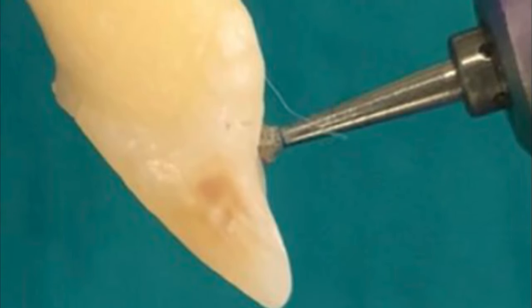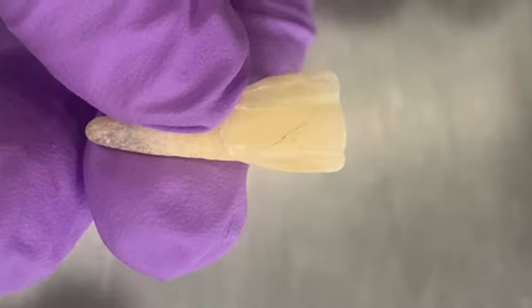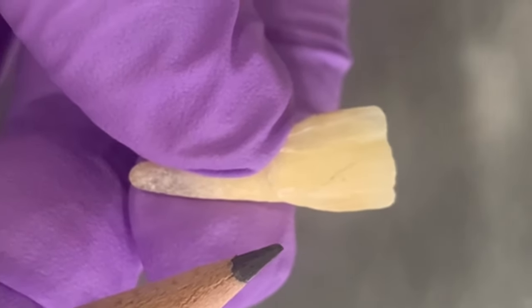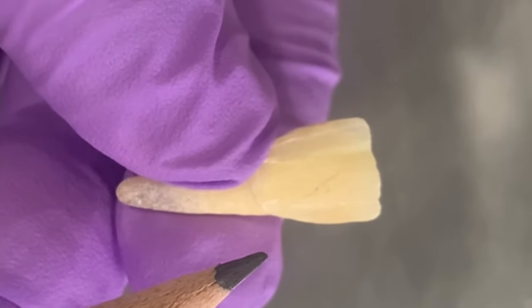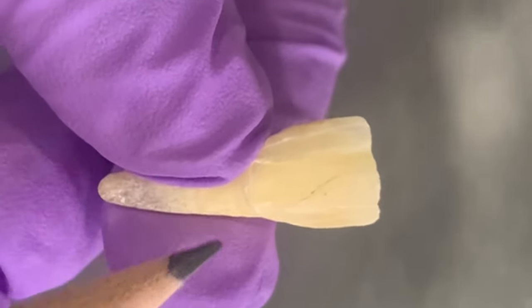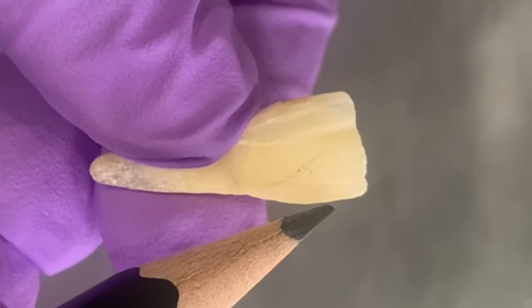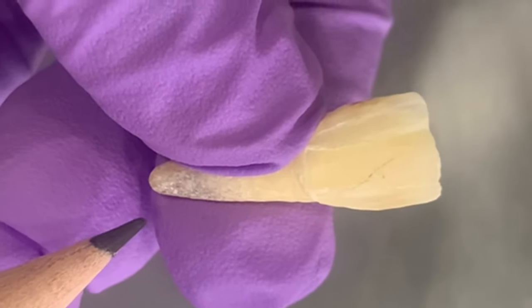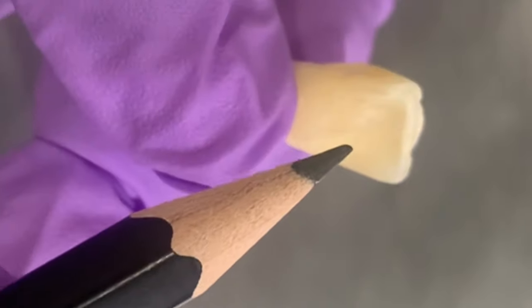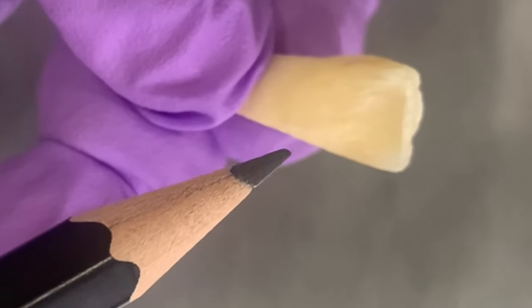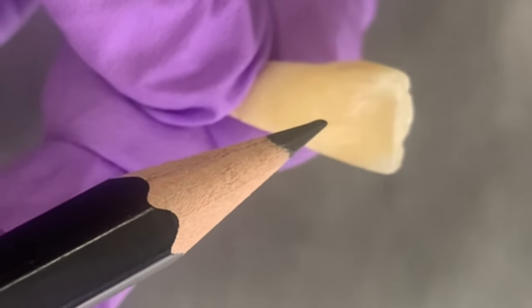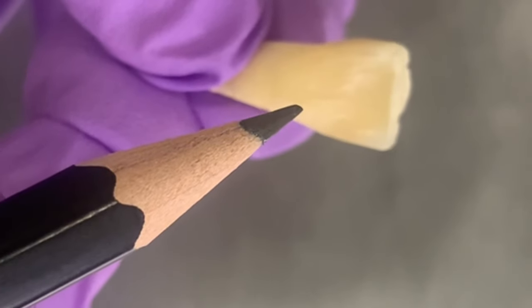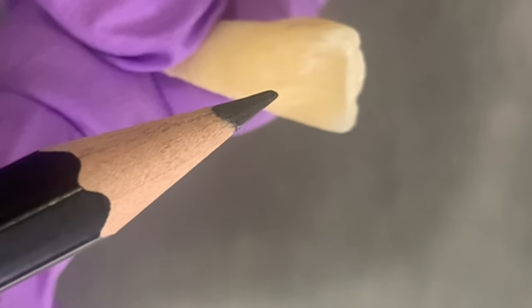Hello everybody, welcome to Brainy Dental. Let's begin with our tutorial. Now this is an extracted maxillary central incisor. This incisor has a length of about 22.8 millimeters and we have a labial surface, this is a lingual surface. On the lingual surface we have cingulum and we make our access cavity at a point just above the cingulum.